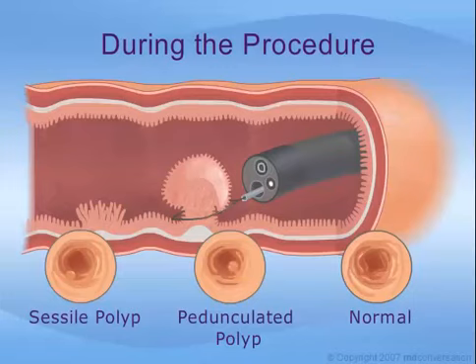Your doctor can also remove a tissue sample, called a biopsy, to test in the lab for diseases of the colon. In addition, if any bleeding occurs in the colon, the doctor can pass a laser, heating probe, electrical probe, or special medicines through the scope to stop the bleeding. The tissue removal and treatments to stop bleeding usually do not cause pain. In many cases, a colonoscopy allows for accurate diagnosis and treatment of colon abnormalities without the need for a major operation.